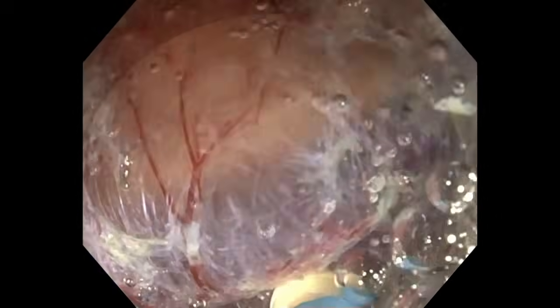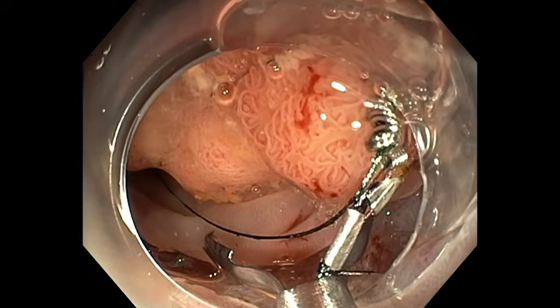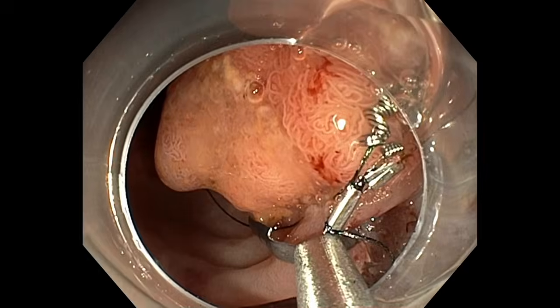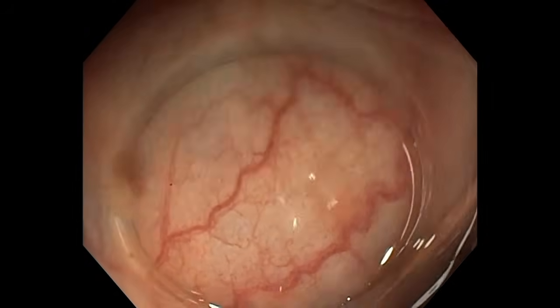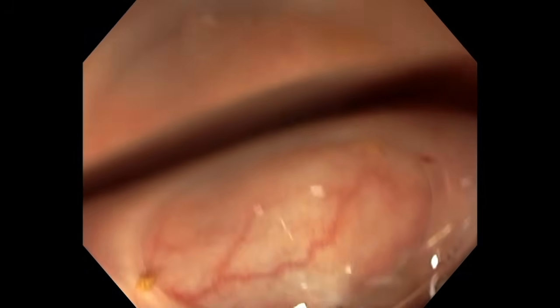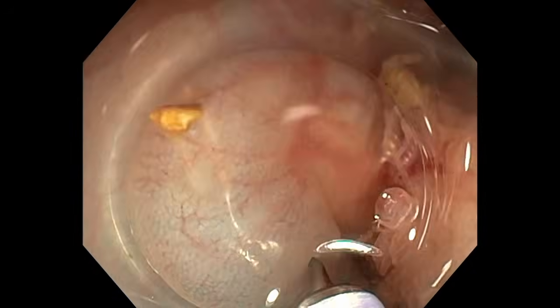So I will do the dissection with a large pocket at the distal part. So yes, I will do a kind of tunneling, but relatively large. Immediately after, I will use a multipolar traction strategy on the edge of the lesion. My goal is to remove the four edges of the lesion from my field of view and see really the blue layer everywhere. So you can see that the wall is attracted by the lesion. We can see that we have a whitish tissue and it's difficult to find the submucosal layer because the muscle is really attracted to the lesion.